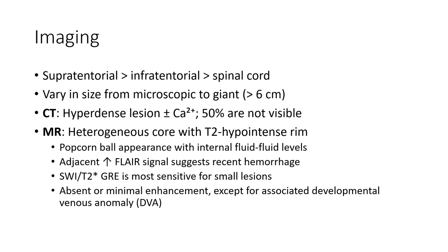On MRI, there is a heterogeneous core with T2 hypointense rim — the classic "popcorn ball" appearance with internal fluid level. Adjacent increased FLAIR signal suggests recent hemorrhage. On SWI, there is T2 star blooming effect.